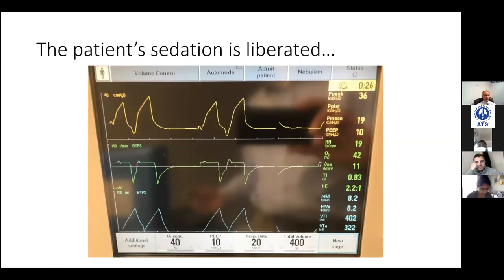Okay, last point, and they might cut us off. We might drop out through the floor here any minute and go back to the main session, but what's going on in this patient? This is our same guy. Now we've lightened his sedation a little bit. What's happening? Remember, flow is your friend. What is the flow telling us? This little pink says that he's triggering that breath. He's not triggering this breath. See that? See this downward deflection in pressure? That's also him triggering, right?